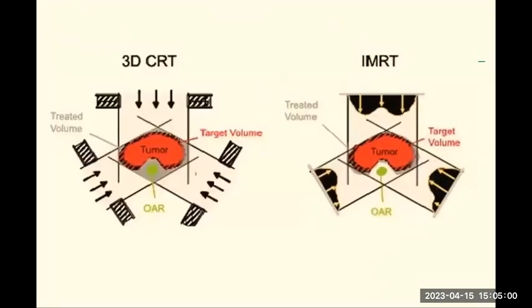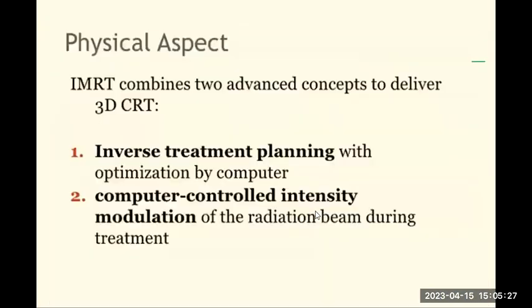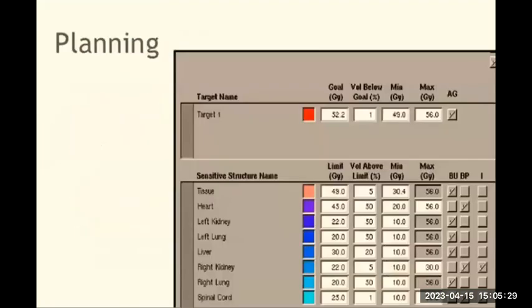This is the IMRT image or the 3D CRT. You can see that we have three directions. Imagine this is X, this is Y and this is Z. From the center, upward is Y, the right-hand side is X and the left-hand side is Z. If you take it that way and place a camera, you can imagine taking a 2D photograph of this tumor from three directions. Hope you understand.